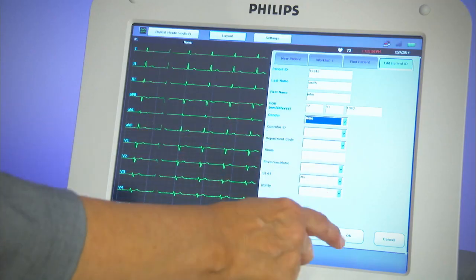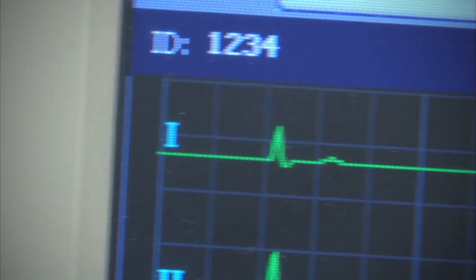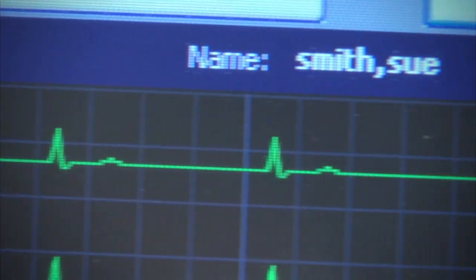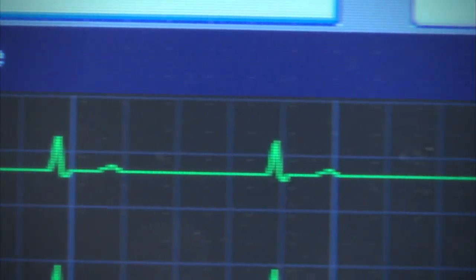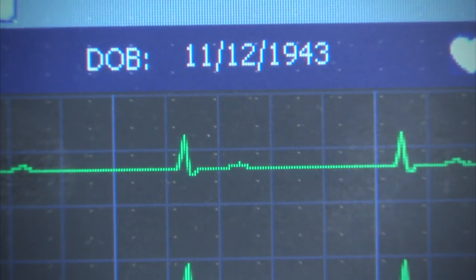When all the required patient data is complete, the ECG button will light up to guide you to preview the ECG. The patient's ID, name, and date of birth are displayed at the top of the moving waveform display so that the operator can verify that the correct patient was selected from the order work list.